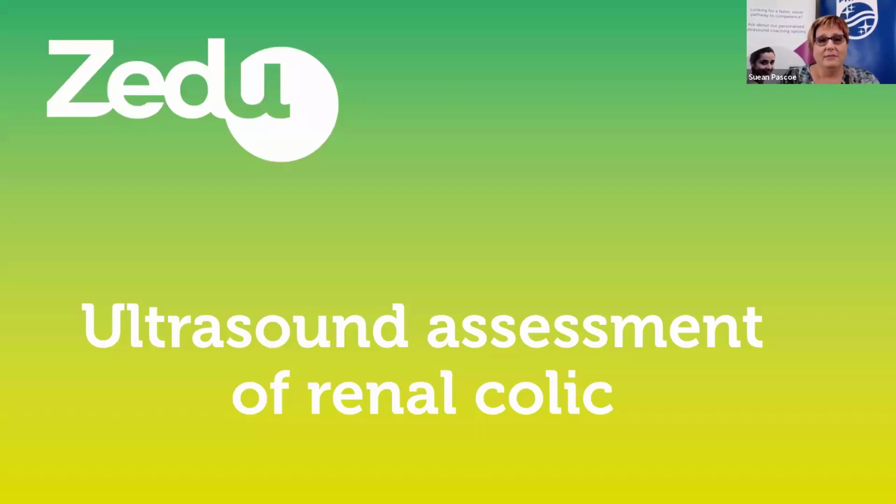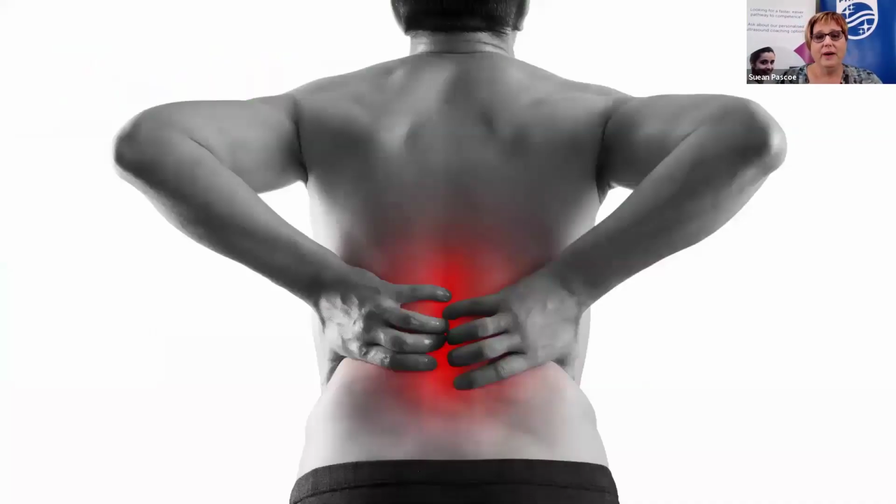Tonight's topic is going to be ultrasound assessment of renal colic. So patients presenting to the emergency department with flank pain and hematuria will inevitably undergo some sort of imaging as part of the workup for kidney stones, so that we can determine the location of the stone and therefore figure out how we're going to treat them or what might be the possible other consequences of this stone.